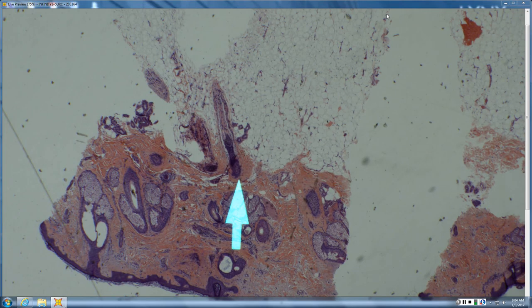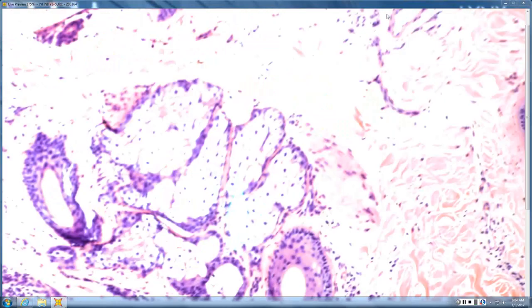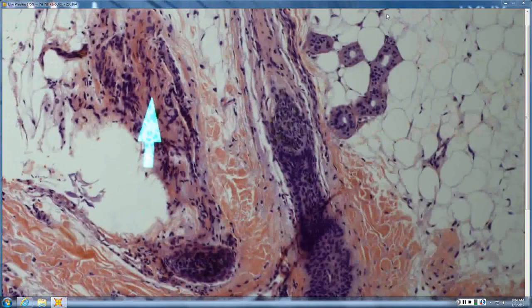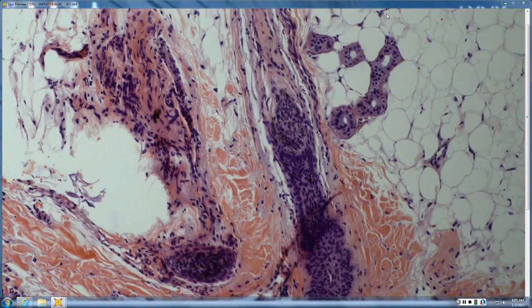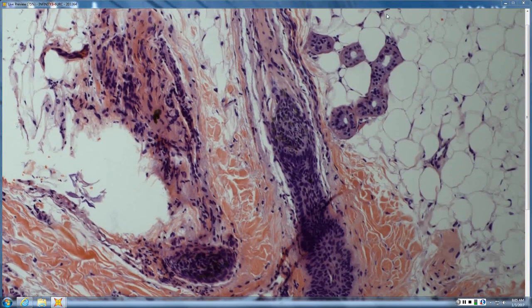So alopecia areata, syphilis, androgenetic would all give you miniaturization. Which of those tends to give you pigment in the fibrous tract remnants? That would go more with alopecia areata. So you've got miniaturization, retention of sebaceous glands, pigment in fibrous tracts, EOs in fibrous tracts, lymphs in fibrous tracts, all of those things would point you towards alopecia areata, but anytime you say AA, you also have to think of the possibility of syphilis.